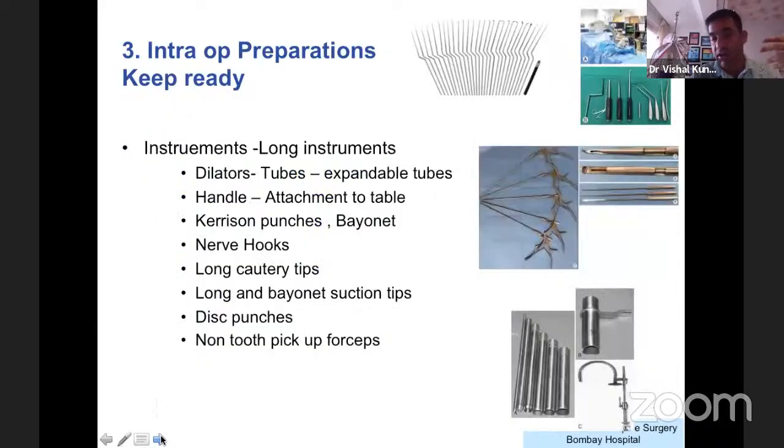Long instruments, different kinds of instruments. You may want to get used to all of these, having proper dilators, different dilators, and a very, very flexible arm attached to the table is something that you may want to keep ready even before your incision comes in. And any of these factors which are not present on your OT table can actually result in your surgery going very, very long, and the struggle factor may just magnify exponentially.